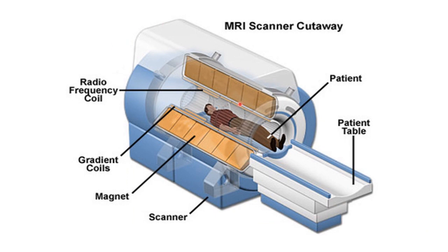So this is an MRI console. It consists of an MRI machine, and the bore is also called the gantry, within which the patient lies on the table. It contains magnets in the outermost diameter, and then as we go inwards, it contains different coils. The outermost is the main magnetic coil, then the gradient coils, and the innermost is the radio frequency coil.